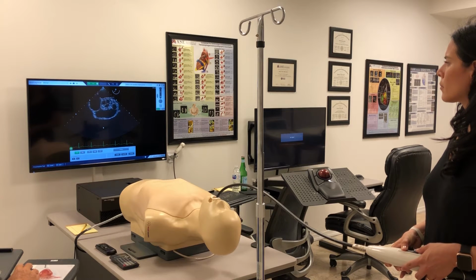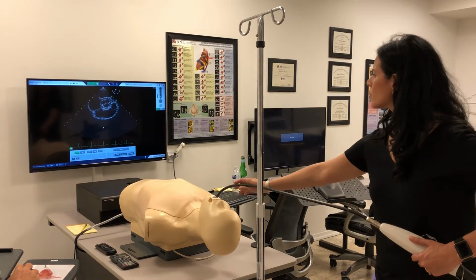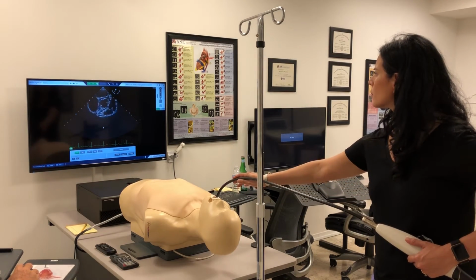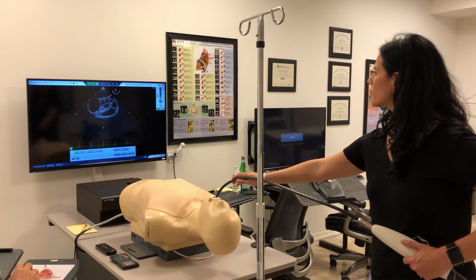Once you get to 40 degrees, you have to decide if you're just a little bit below the valve, in other words, more apically in the LVOT, or if you're above it. If you're above it, like right there, that means you're in the ascending aorta. When they're just kissing, you're just in the perfect spot.